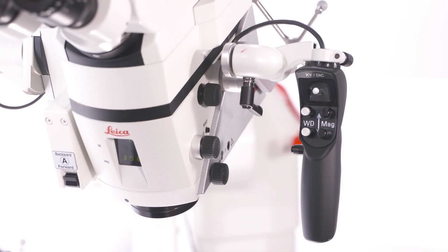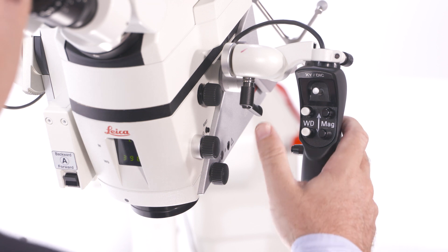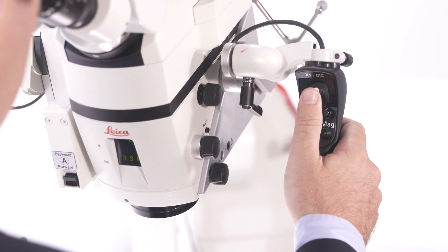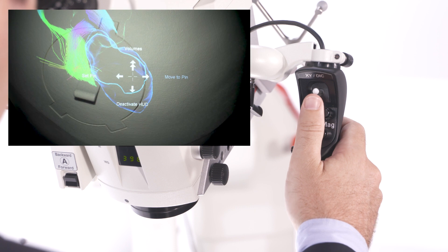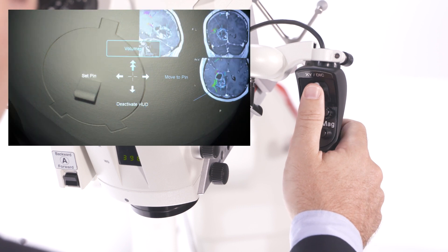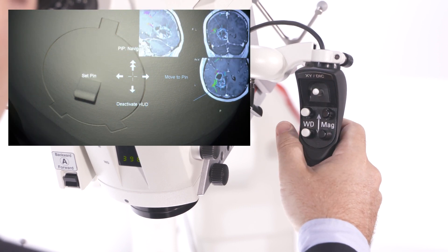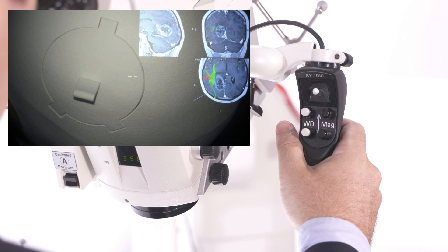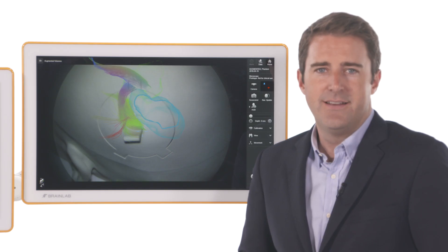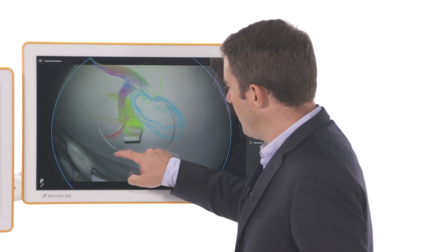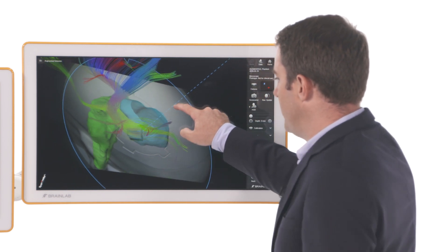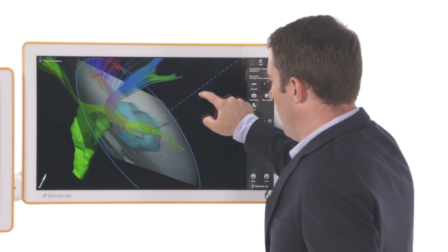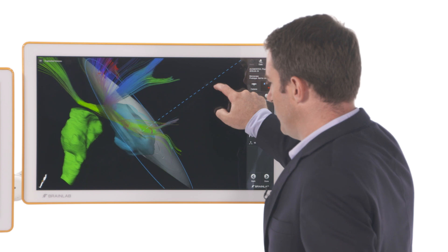Handle buttons can be used to remotely control navigation functionality like adding picture-in-picture navigation views. This consolidates procedure-critical insights without the need to look away from the microscope. Rotation of the video plane further improves spatial orientation by revealing a more comprehensive picture of the surgical situation.